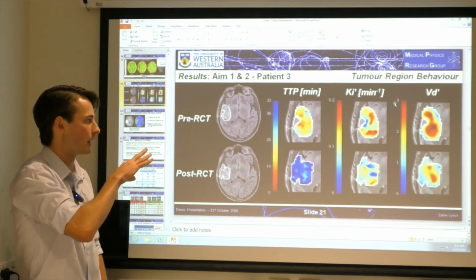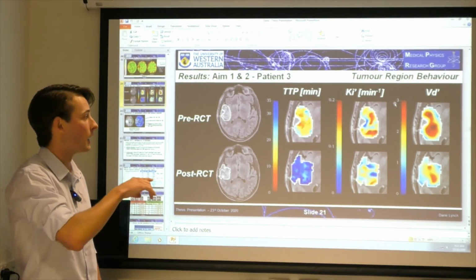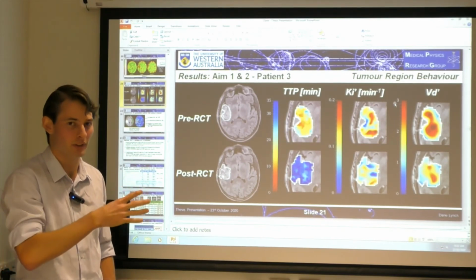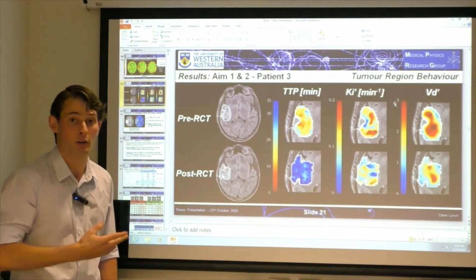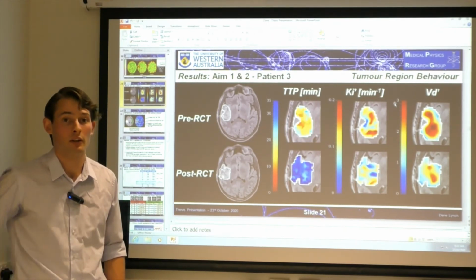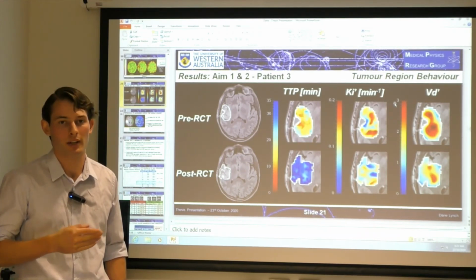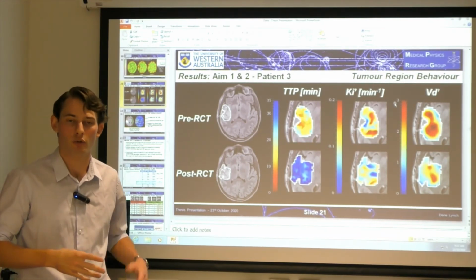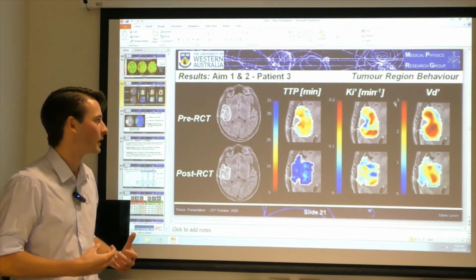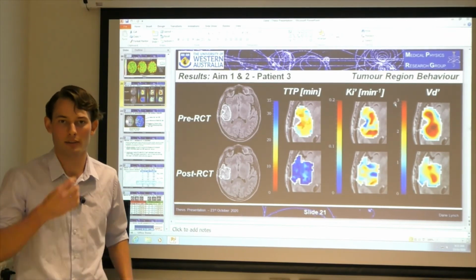It's semi-automated because she had to manually remove some regions that only a specialist can recognise aren't part of the tumour region. So it was not done by me, no. And it was only the one observer. Ideally, if this study was done again, you would have maybe 2 observers create 2 versions of the tumours to account for observer bias.